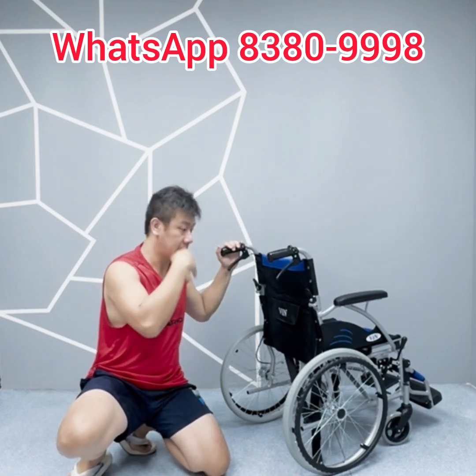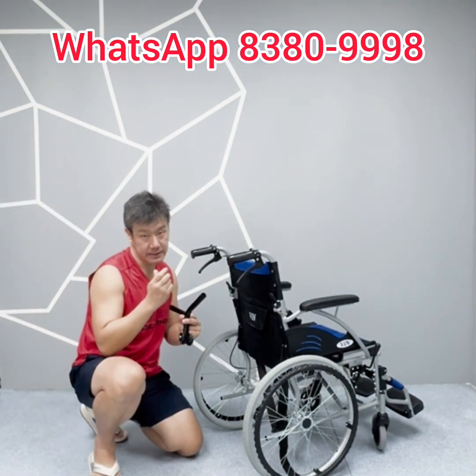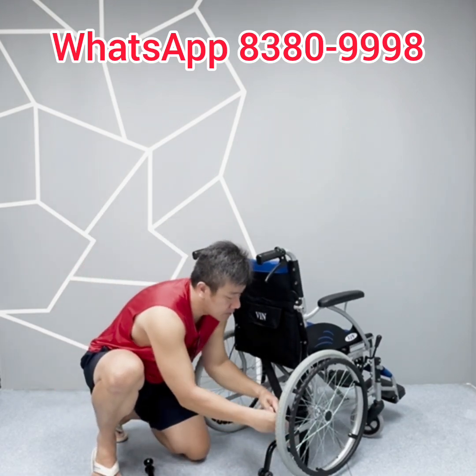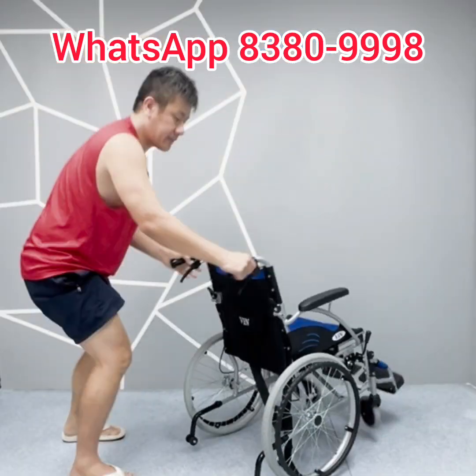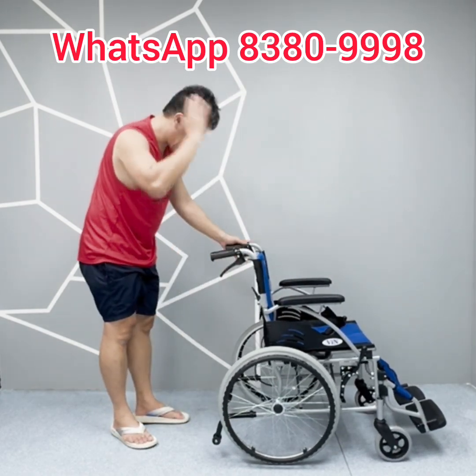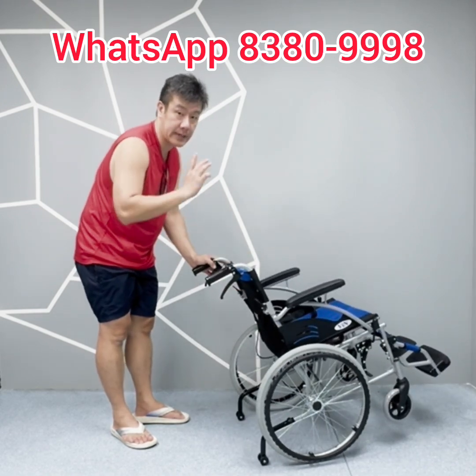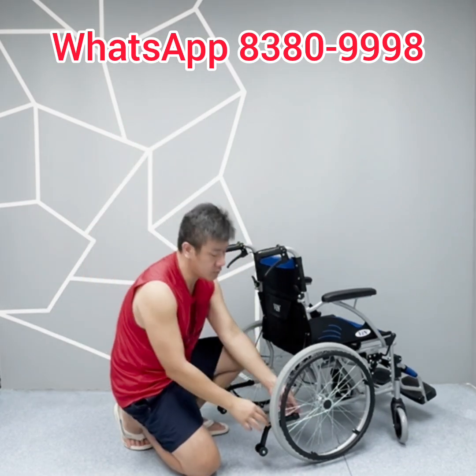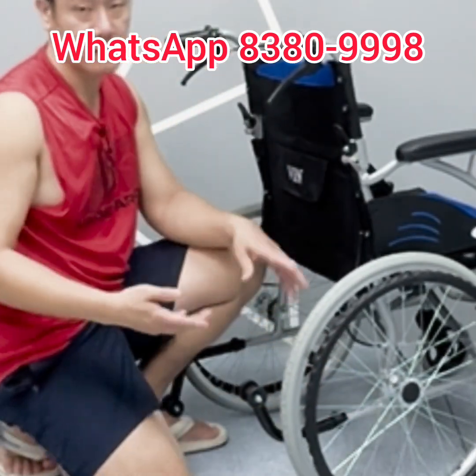This wheelchair also supports an optional upgrade with an anti-tipper. You simply store it at the rear and lock it in place. The anti-tipper prevents the user from tipping backwards and causing injury — useful when propelling upslope or on uneven ground. If you do not need it, it will not be included by default. You can remove it in seconds or simply flip it upwards when not in use.